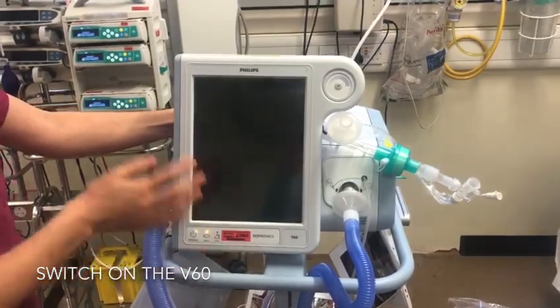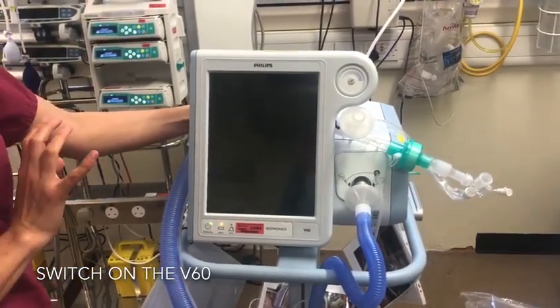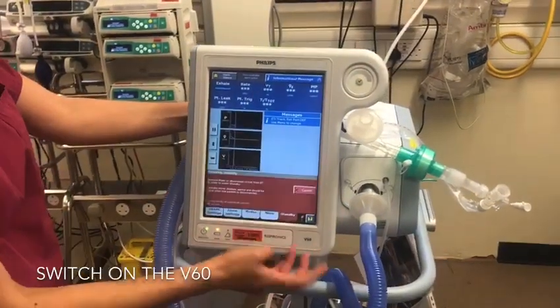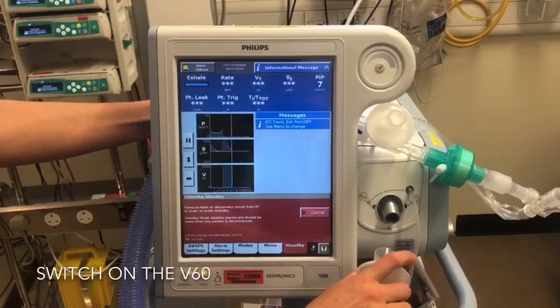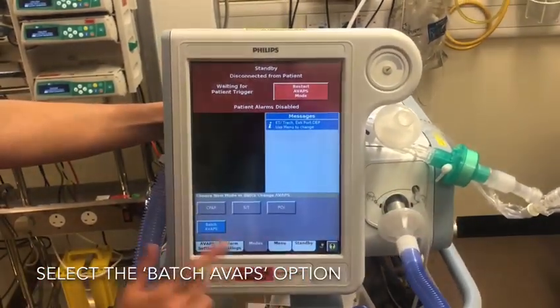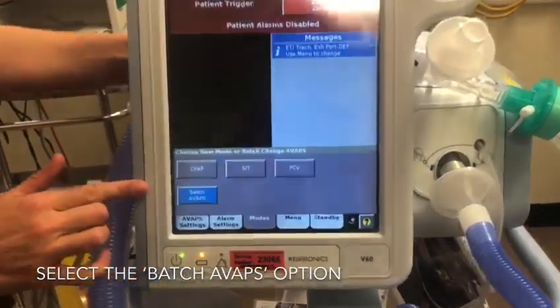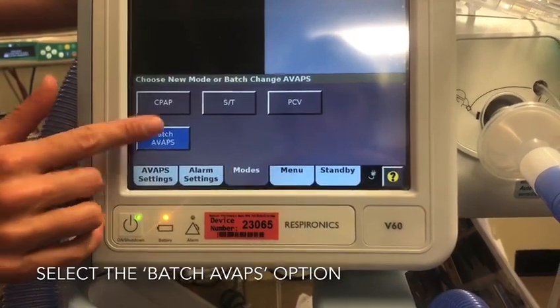Hopefully you'll turn your ventilator on before your patient arrives and you can put it on standby and check your settings. To place on standby, press standby and disconnect from your patient. We then check our mode. For ventilating patients who are intubated, you go to your batch AVAPS.